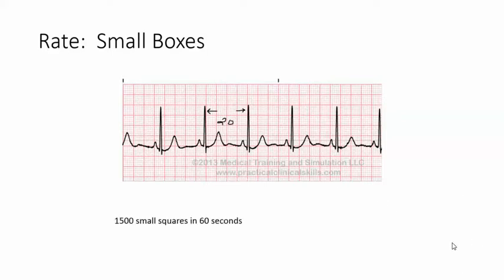There are 1500 small squares in 60 seconds. There's 150 small squares in 6 seconds, multiplying both by 10. So you take 1500 and divide that by the number of small squares between the two R waves and that gives you the heart rate. Again, this is ventricular. You can do the same thing with the P waves for the atrial rate. 1500 divided by 20 equals 75 beats per minute. And that's it.